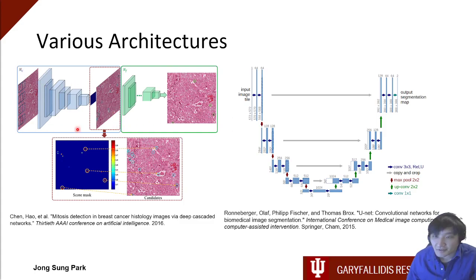In a cascaded network, it has a coarse network first, which searches for a patch of the image that is important. And from that important patch of the image, it runs a finer network to reach its goal, whether it's segmentation, classification, or anything else.